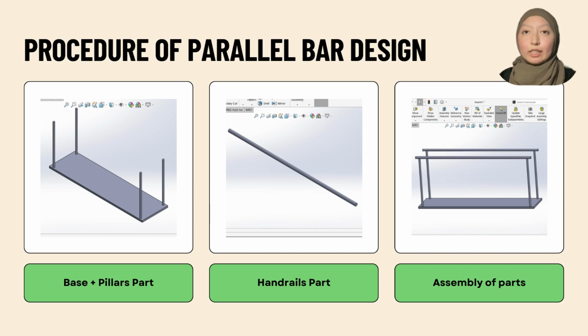Each handrail was designed as a cylinder with a length of 3010 mm and a diameter of 60 mm. 2 slots were then created along the handrails with a depth of 30 mm to accommodate alignment of the pillars. In the final stage, the assembly of the base and handrails was performed using SolidWorks assembly. The handrails were carefully positioned above the pillars and mates were applied between the inner slot faces of the handrails and the outer surfaces of the pillars, forming a complete parallel bar structure ready for simulation analysis.